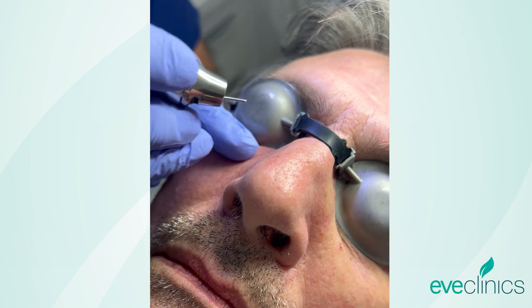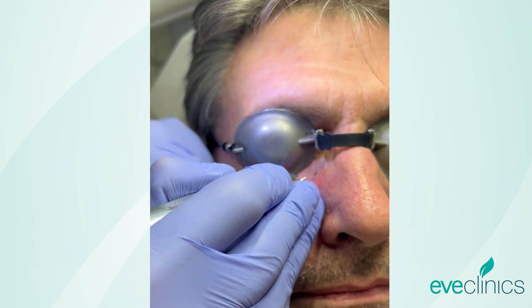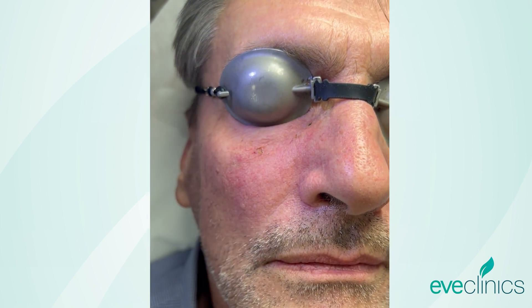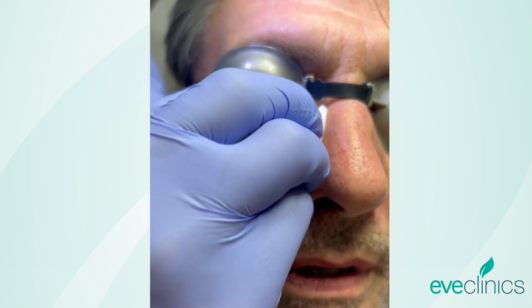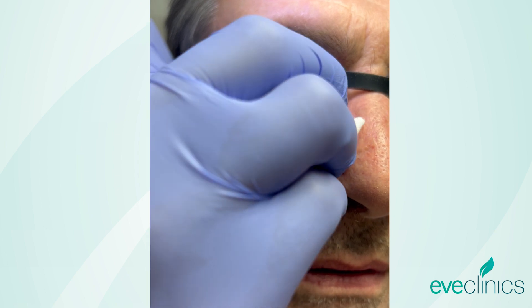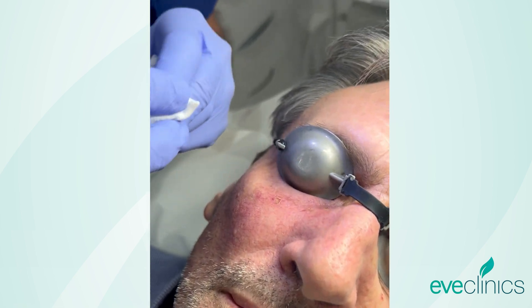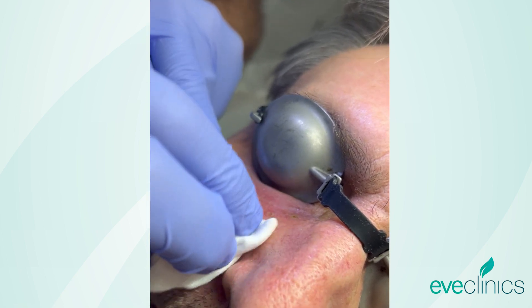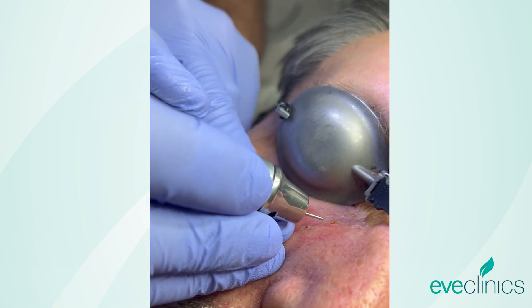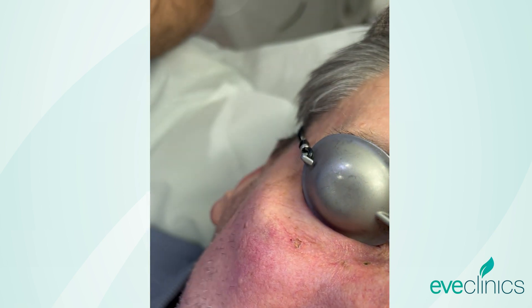I'll just finish the job off. Can you do this as part of a more major resurfacing? Absolutely, it could all be included at the same time — it could be done in one sitting. Often it's best just to take one process at a time, but if need be we could certainly — it doesn't stop you from doing other treatments around the eye.